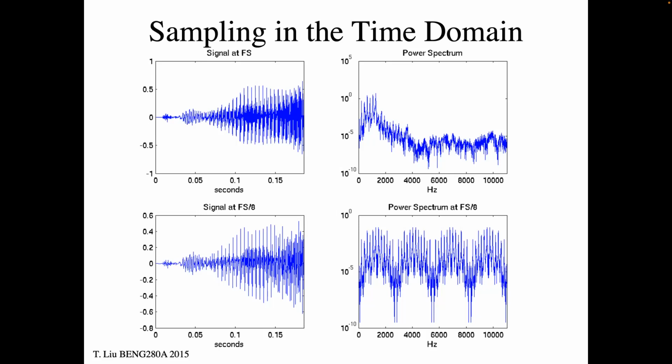You look at the voltage per unit time from that signal. And you're going to make a super high resolution picture from that signal, which when I first saw it, I was like, what the heck? How do you do that, right? It's a radio frequency signal. The wavelength of that energy coming out of that patient is measured in meters, right? So how are we going to make a picture that's on millimeter scale from that signal?